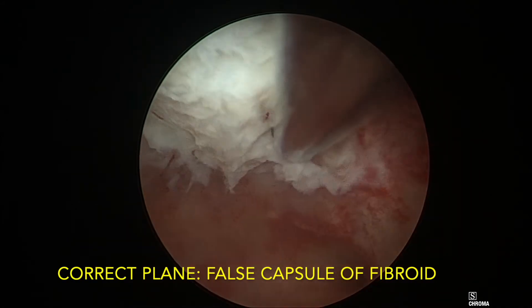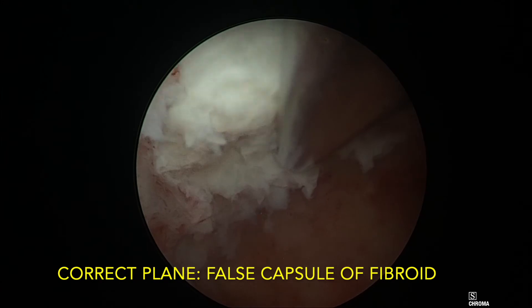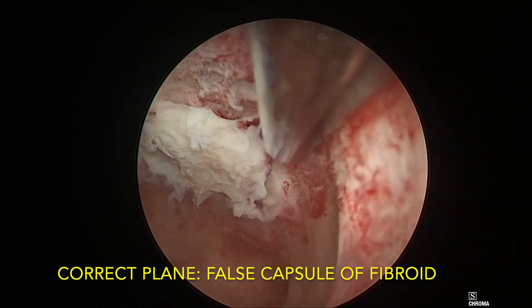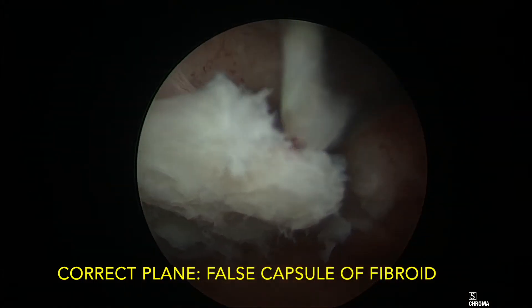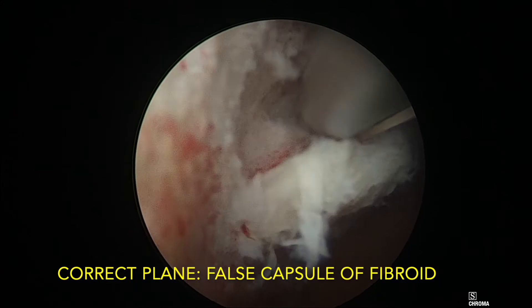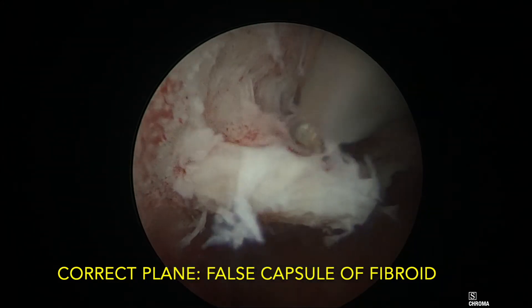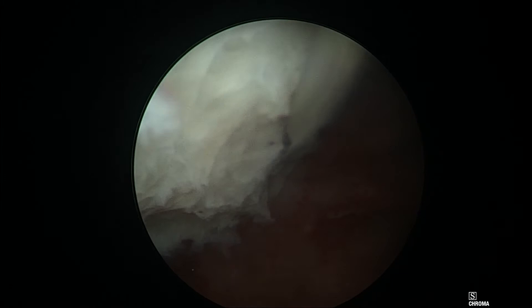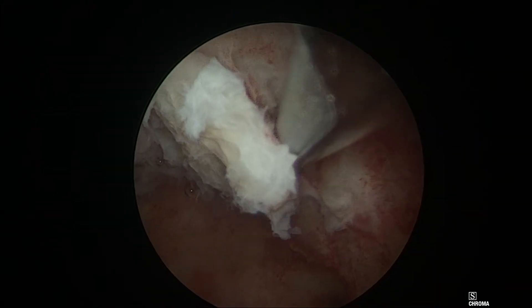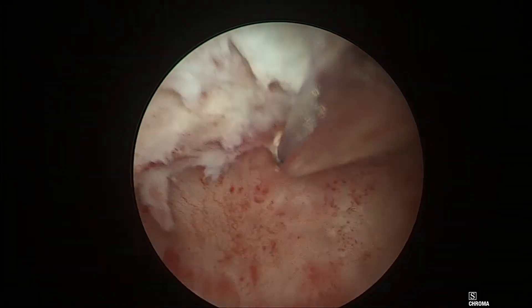A Myosure Reach device is used for this procedure, although Myosure Excel would have been the ideal one. You can see we started resecting the fibroid from one edge and moved on to the other side. Now we are getting into the plane which is known as the false capsule of the fibroid, and I'm trying to separate the fibroid from its surrounding environment.